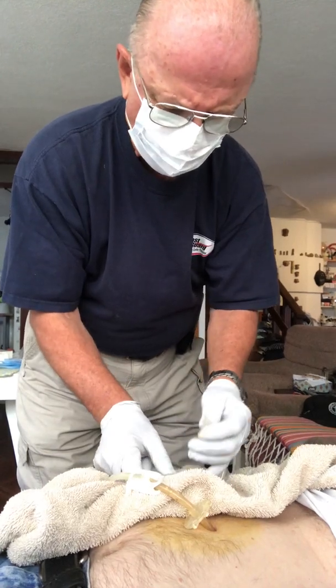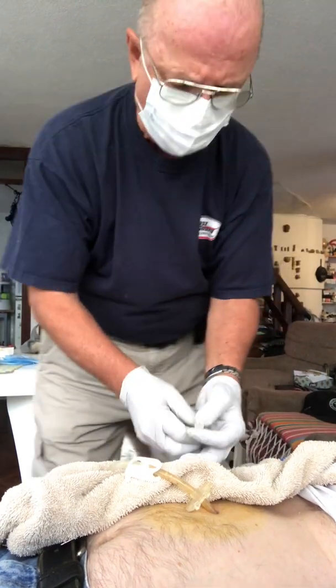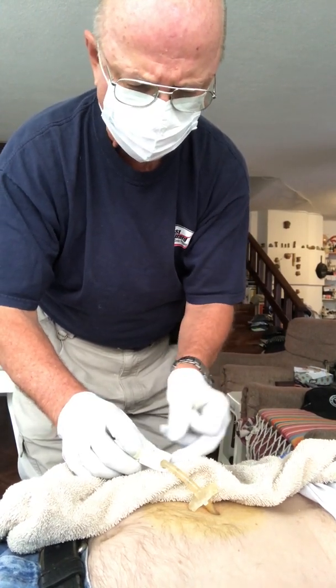There you go. See, now the air is coming out. I just took this apart because this is going to go in the trash. And that was simply by hand. Well, actually, I'm going to need to open. Yeah, just by hand. I'm going to open this up.